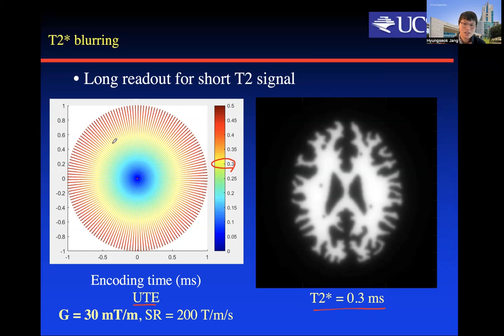That means when we get to this yellow point from the center out, our signal has already decayed to exponential minus 1, which is about 37%. So only 37-something percent remains at this point, and then as we go further it decays more toward 0.